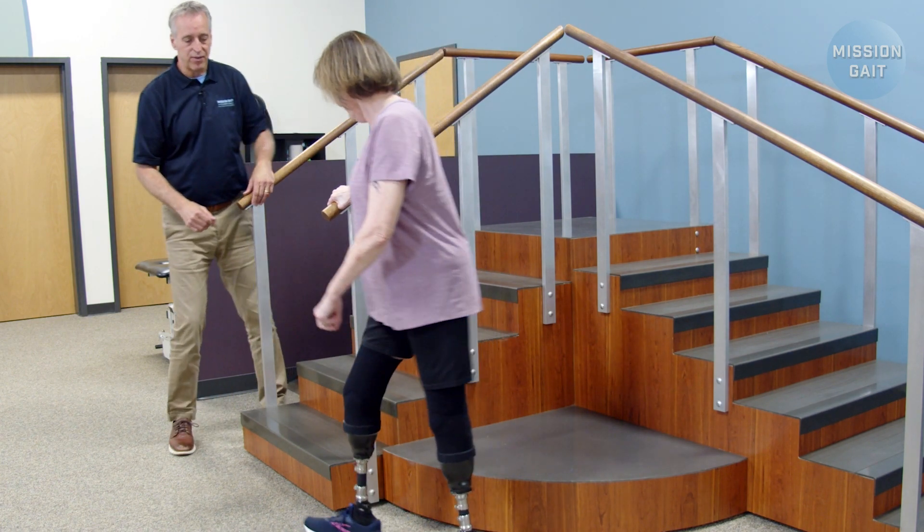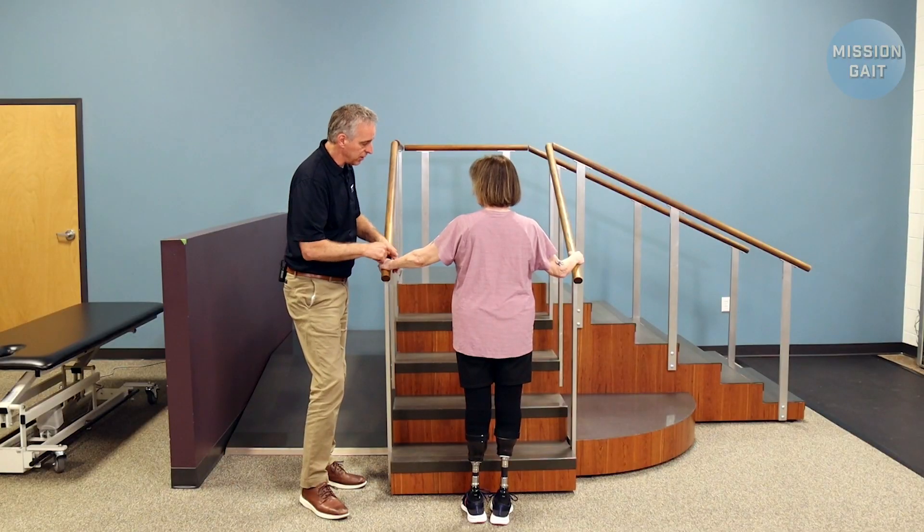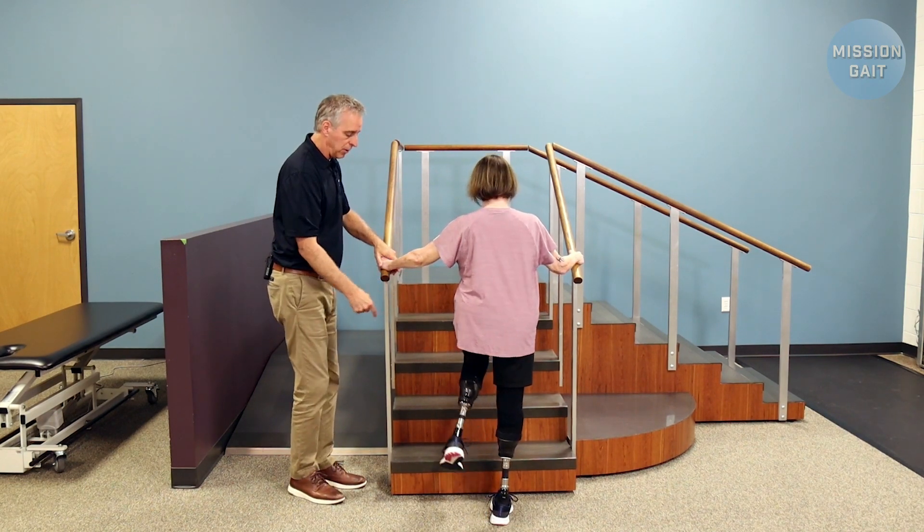So with that being said, Stephanie, come on around to the front here. All I want you to do is both hands on the rails. If we're lucky enough to have two rails that aren't too far apart, she's simply going to put one foot up.